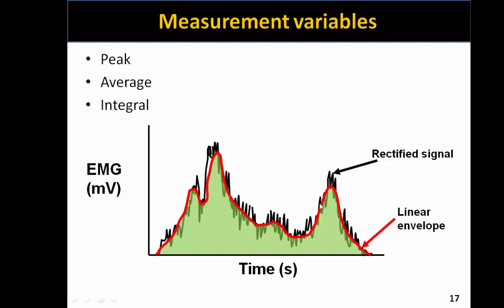So this smoothing approach will now allow us to get away from these very sharp peaks and valleys, and gives us an opportunity to make a little bit more of a definitive indication of the level of activation of a particular muscle. One approach is to take the peak amplitude, and when we talk about amplitude, that's the deviation along the y-axis. It's essentially how high the activity is. And so one way is to take the very highest value.